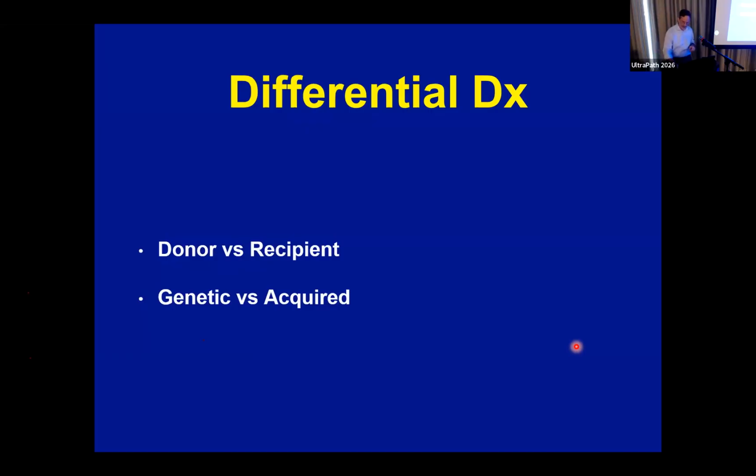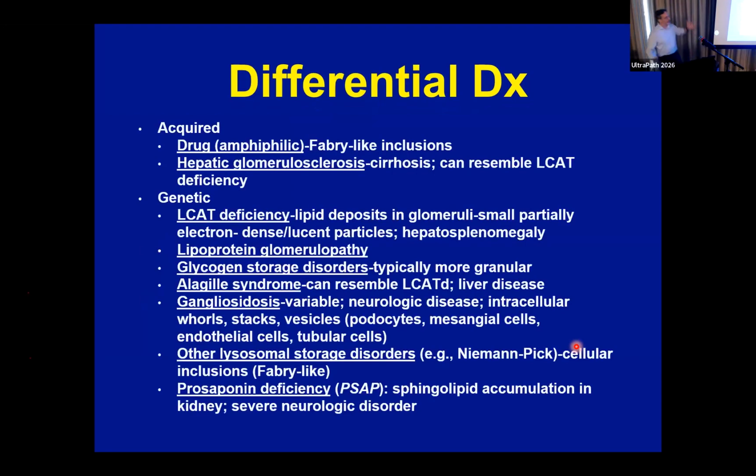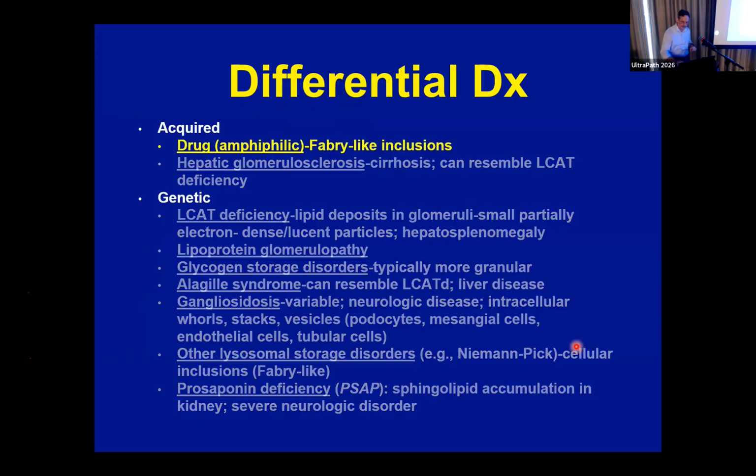What actually is it? So here's a broad differential of deposits, and this is not exhaustive and doesn't even include some of the things, Giovanni, that we just heard about in her talk, of things that you can see. And I'll be perfectly honest with you, most of these things are very, very rare, and I haven't seen them except in textbooks. I've seen a few of them, and I'll run through just a couple of things.